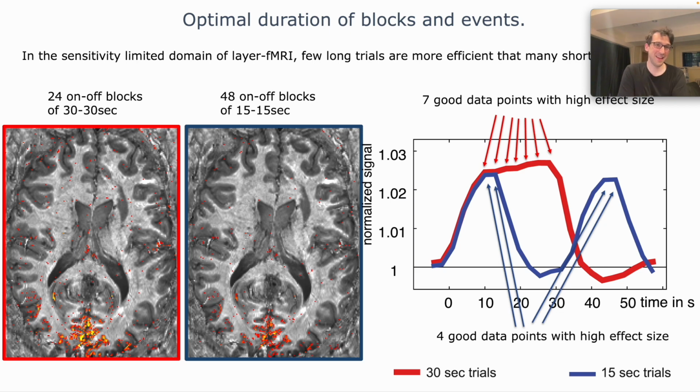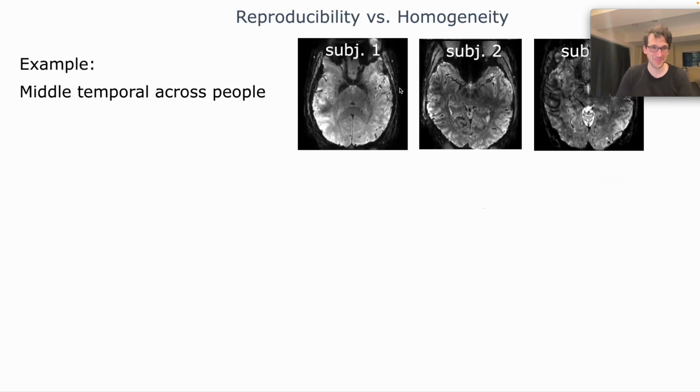But very often you're also deciding whether it's possible to do something in a scan slot or you cannot do it. And very often there are also very clever designs out there, old designs, that you can take advantage of to also look at fast response designs with long blocks, for example.